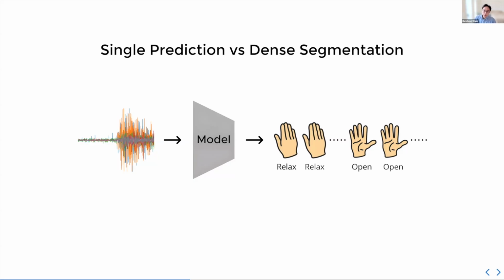But there's one more challenge when we do this in the dense segmentation approach, which is that EMG is very non-stationary. So as I showed you earlier, it can change drastically. And it really responds to change in the underlying intent, right? So it's not like your typical time series, such as weather data or electricity usage data, which are more periodic. So EMG is really non-stationary. And if you open your hand, it reflects on the EMG. And we never know when the person has opened or closed their hands.